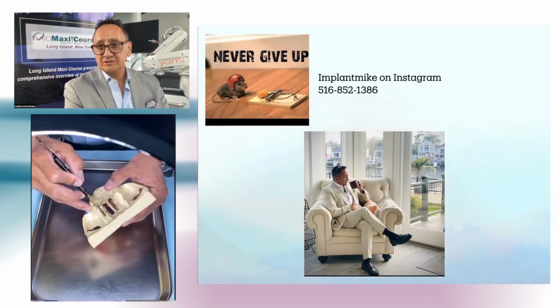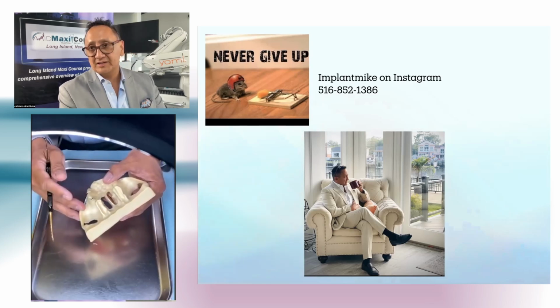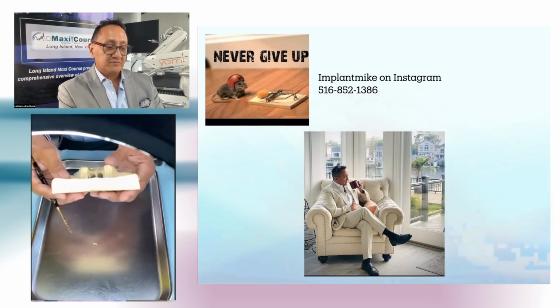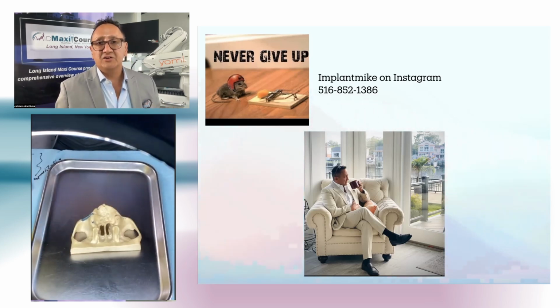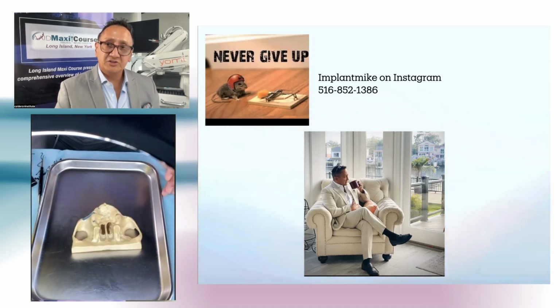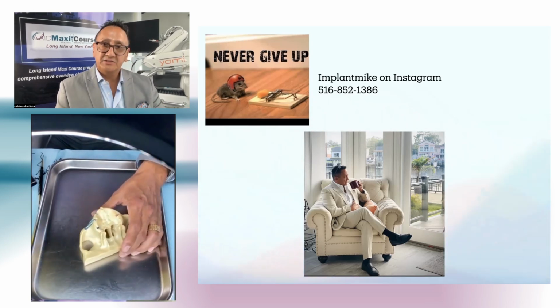And that's where you start using the CAT scan. You can use guides, or you can use the Yomi robot for that. The Yomi robot works fantastic because everything is done the same day. So if somebody comes to me in the morning and says, I want to get this done, pre-medication, we start the workup, we connect the Yomi, the CAT scan is done, I do the treatment plan on the CAT scan, and then all of a sudden the Yomi's doing all the work for me. So Yomi is a great investment. If you're going to do a lot of surgeries and things that are technique sensitive, you need to do that.